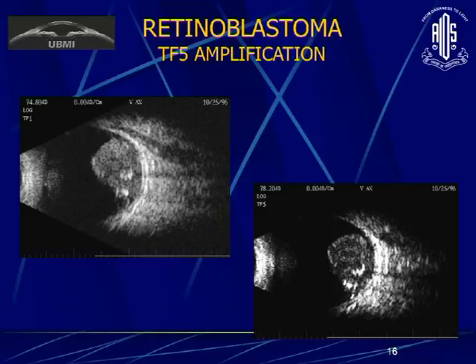Now if you look at this patient here, there's probably some shadowing. We are not very sure. It's a mass lesion with few echoes inside. When I reduce the gains here or use a different amplification, I can highlight the calcifications very well. And there are microcalcifications. They need to be seen with very reduced gains.